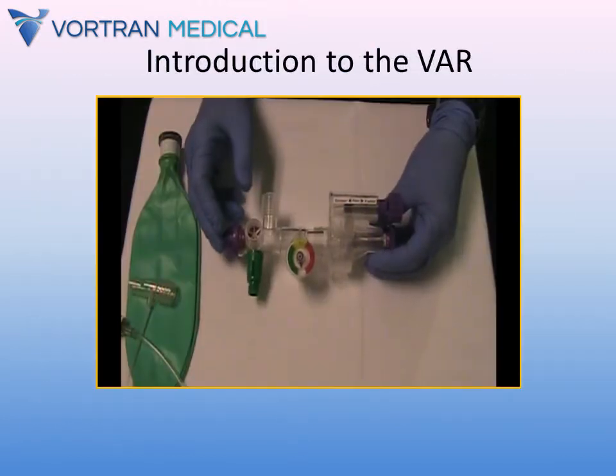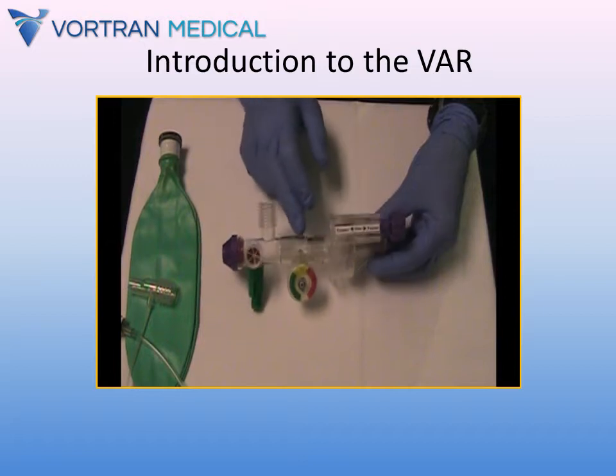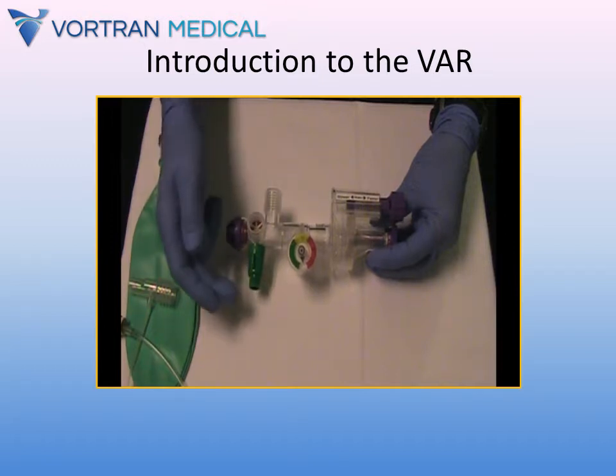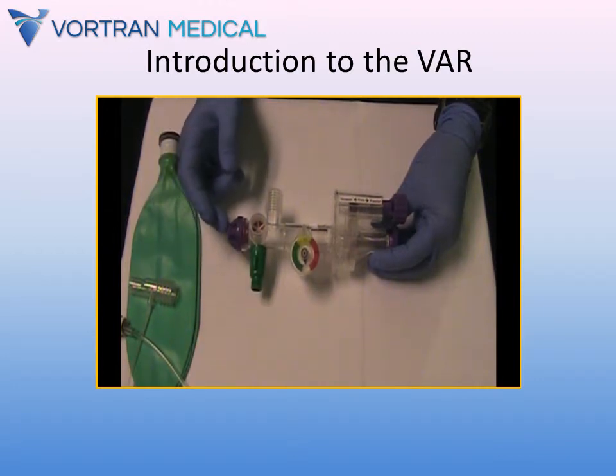The VAR has some very substantial advantages over the bag valve mask, and we'll go over those right now. First, you can see the VAR is plastic and entirely clear, so we can see if anything clogs the airway at any time. Here is the oxygen entrainment port. You're going to attach your oxygen supply here, and we generally use somewhere between 6 and 10 liters a minute of oxygen, which is quite a savings over the 15 liters a minute that we use in a bag valve mask.